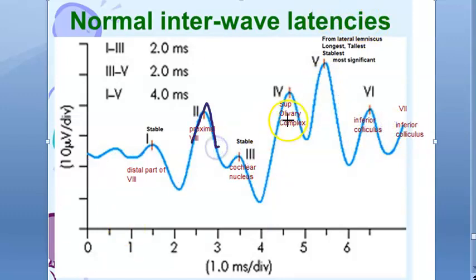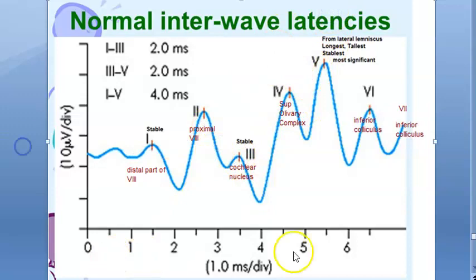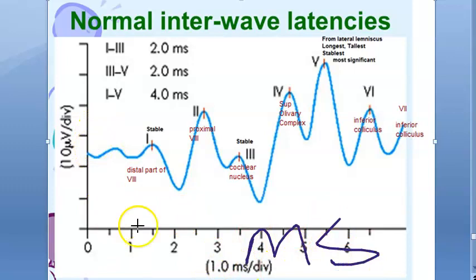2 is a little high. 1, 2, 4 and 5 are kind of progressing in the same way. Like this you can draw. But only between 2 and 4 there is some dip. That is 3, okay? Here you have millisecond, guys. 1 millisecond they are showing here. And here they are showing you some potential, voltage, okay?